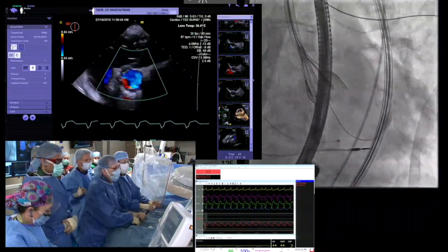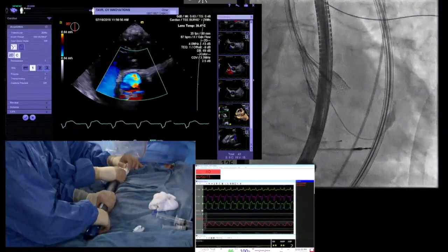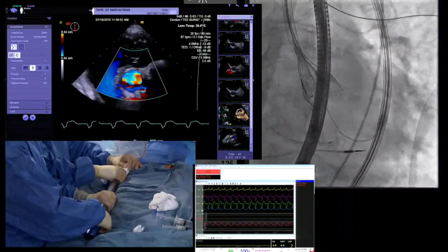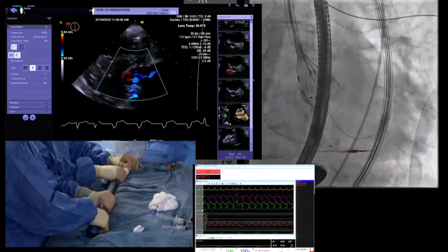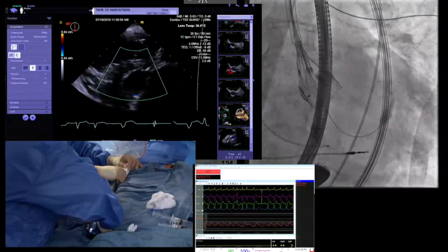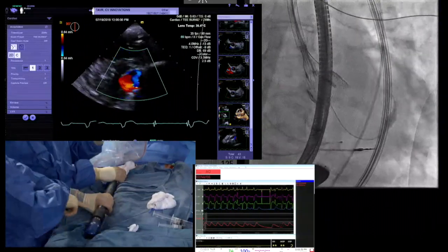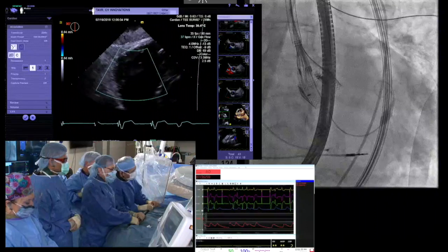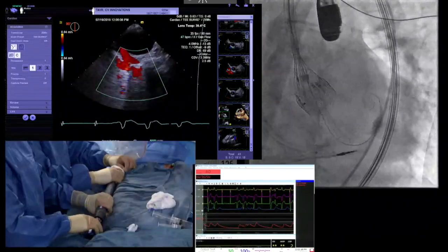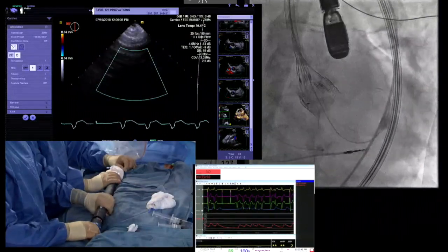I'm going to go to release. Bob, I'm going to go to release. Are you good with that? Yes. Okay. So yeah, I just now saw two little jets, but very, very small. We'll go to end of travel on this. Fluoroscopically, come out so the probe's not in the way, please. A little bit more. Get that out of the way, sorry. There we go. Okay.